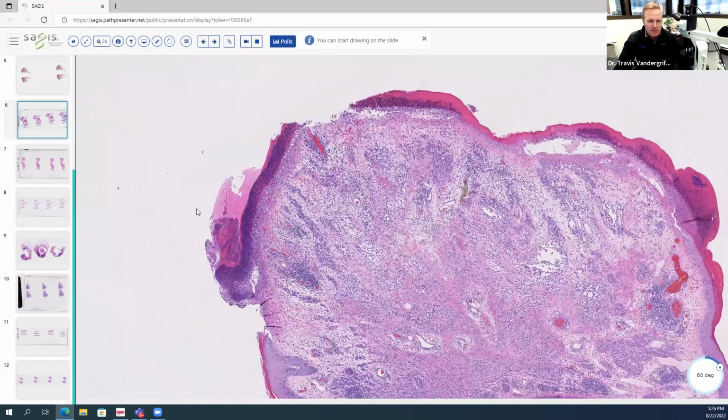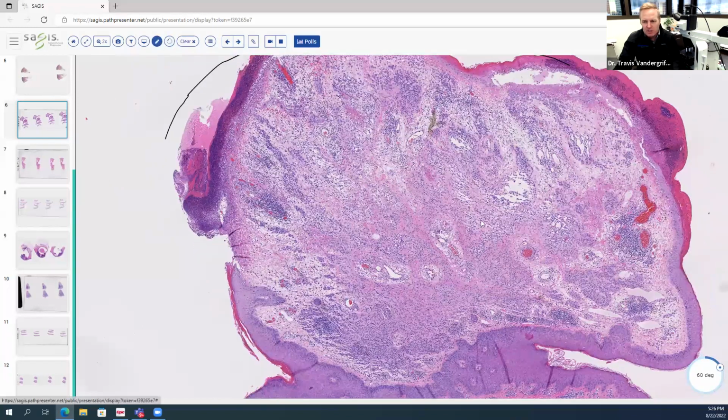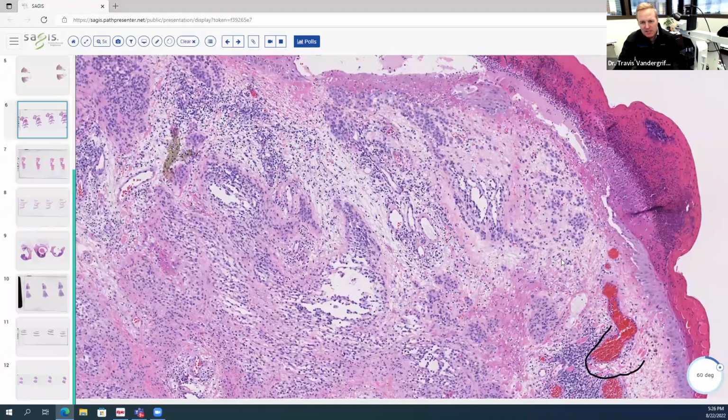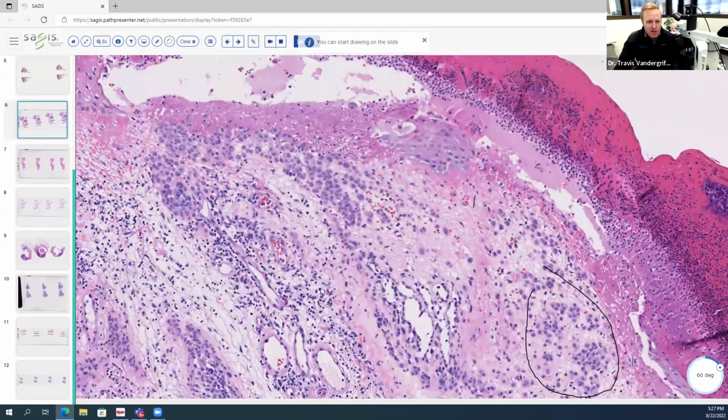So it's ulcerated and crusted. There's some edema in the stroma, which is this pallor. There's also a proliferation of congested blood vessels. All of that suggests a pyogenic granuloma. So you've got the silhouette that looks like a pyogenic granuloma. As I go to higher magnification, I can see we also have a population of melanocytes here, small round melanocytes nested in the papillary dermis.